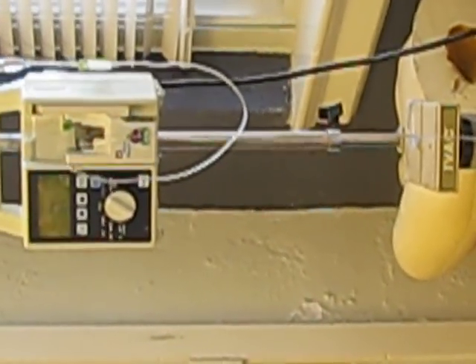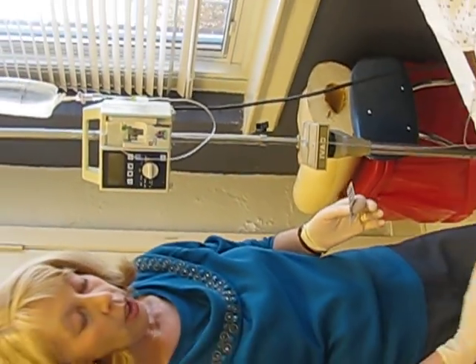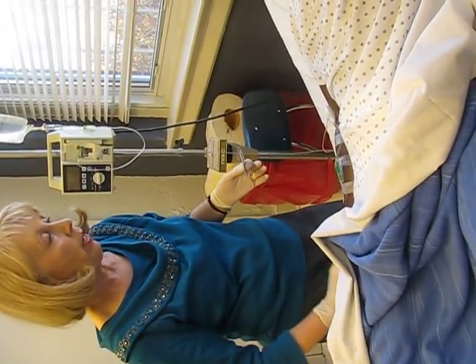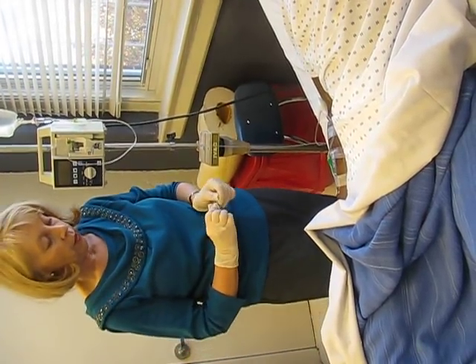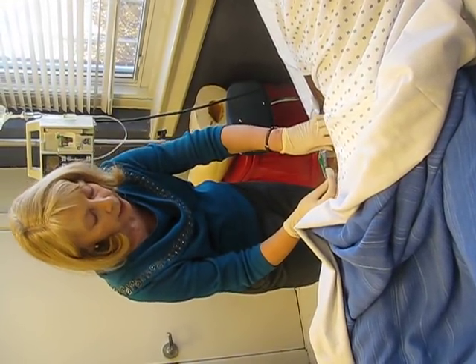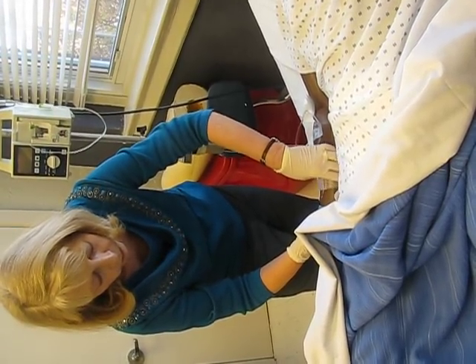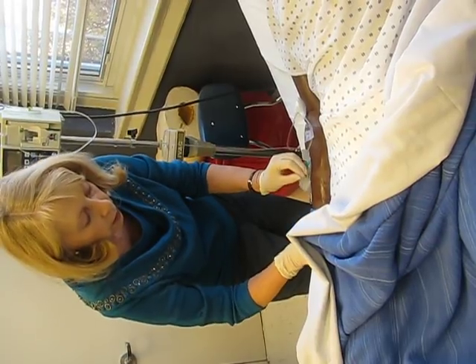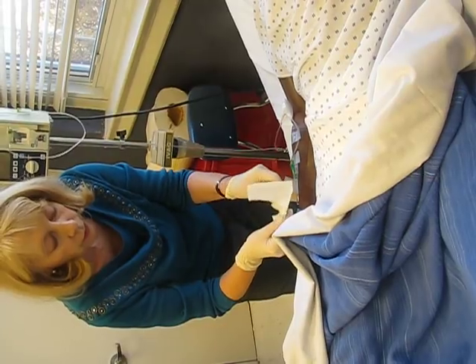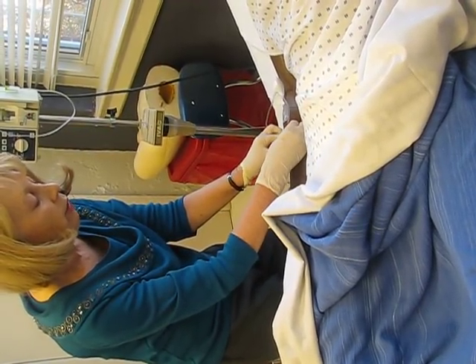So what if we need to DC this IV? You'll need an alcohol pad and a two by two. You'll turn everything off. You'll go in, identify the patient — would you tell me your name? We're going to take out your IV fluids; the doctor's ordered that they come out now. This won't hurt — you might feel a little bit of pressure. I would use an alcohol pad to loosen the tape, lift up the sides — it cuts the tape nicely, especially with these op-site dressings. You take your two by two. You do not apply any pressure on your site while you're removing the catheter — you're not removing a needle, you're removing a catheter. So put your dressing down to cover so it won't splash.